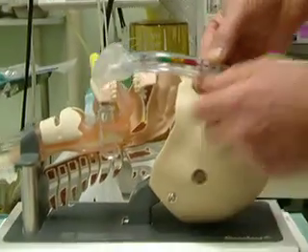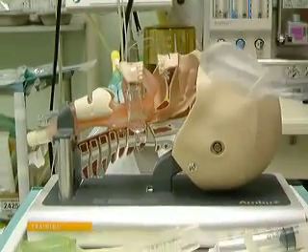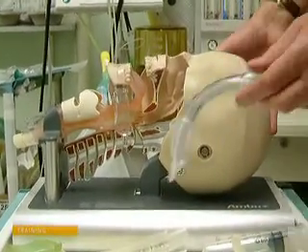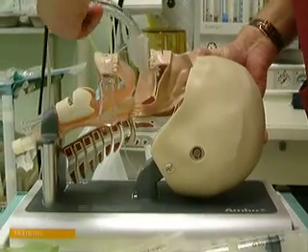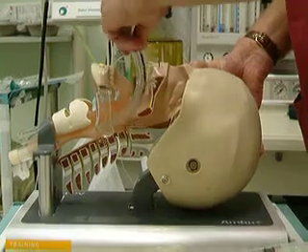It is a low-pressure device. If I insert it — I am using a mannequin here — you insert it and you go behind the tongue.